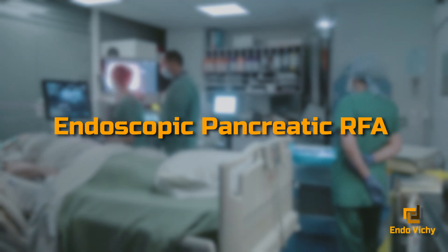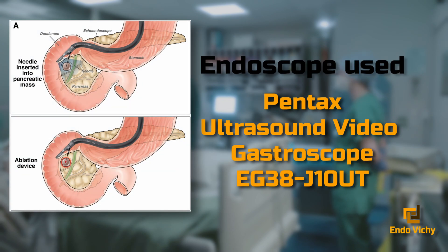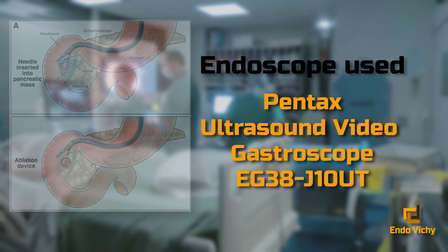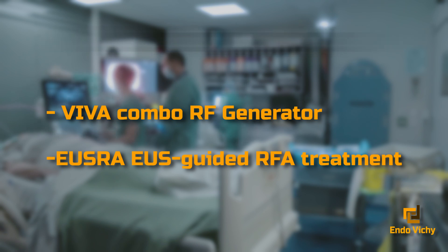We present today a case of EUS-guided pancreatic radiofrequency for the treatment of a grade 1 juxta-centimetric neuroendocrine tumor, discovered incidentally in a young patient who requested treatment rather than monitoring. The treatment decision was validated beforehand in a multidisciplinary meeting, and the diagnosis is proven histologically thanks to the FNA performed during the initial echoendoscopy.